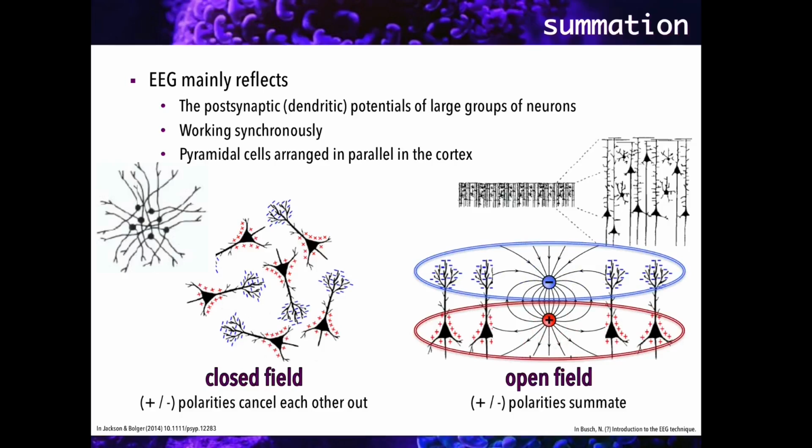Keep in mind, however, that the larger the pool of neurons involved in synchronous activity, the stronger the electrical field they produce, and thus the farther away that they can be measured. That means that a large dipole deep in the brain may still be measurable at the electrode site, although it may contribute to a smaller signal than the surface does.